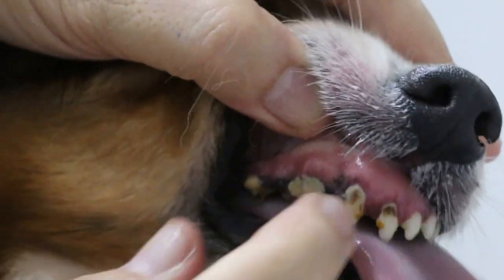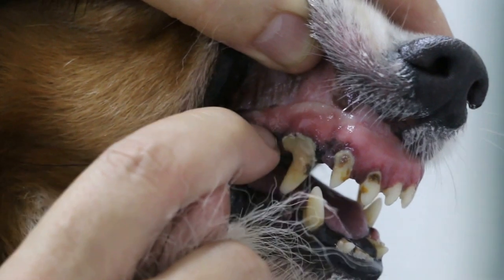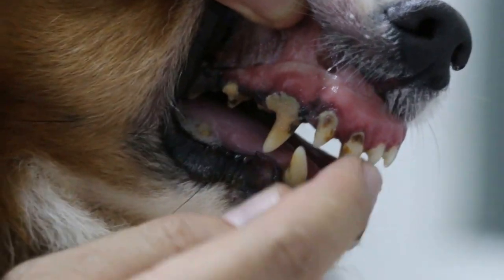Overall, this is gingivitis, tissue attachment loss. Normally the gum line should be up to here — it should be a horizontal line like that — but now the roots are exposed and there's bad breath. But overall, the dog is in normal condition.